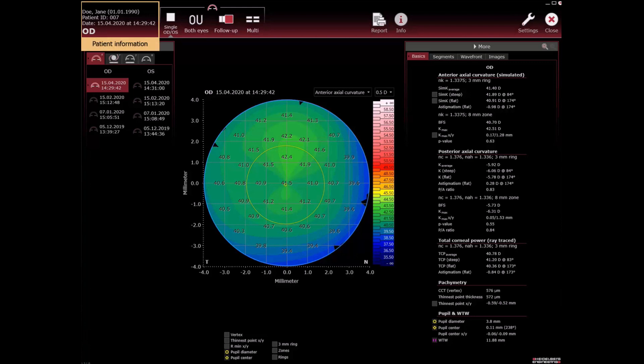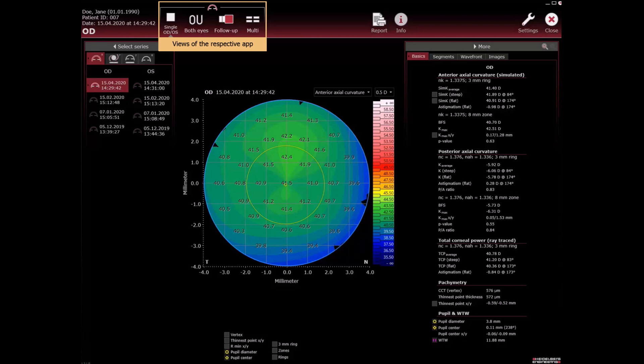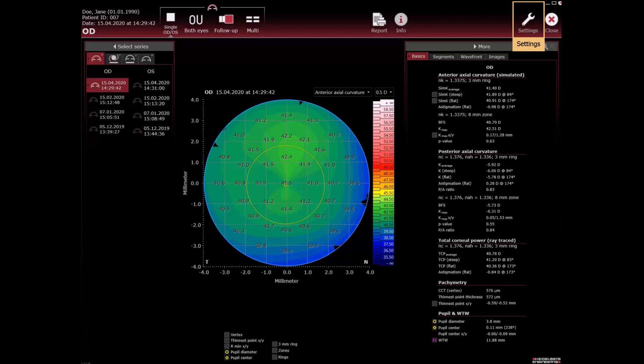Patient information, different views of the respective app, settings and default settings button to configure the settings for the analysis window. Which buttons are displayed depends on the role you are logged in as.